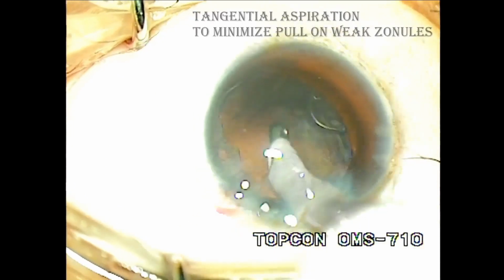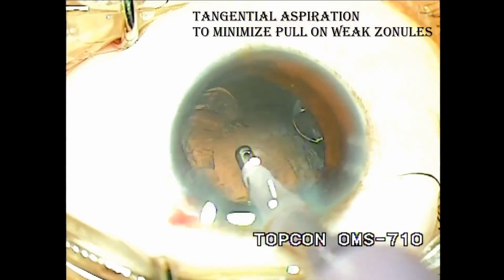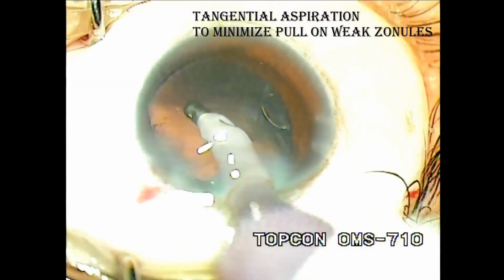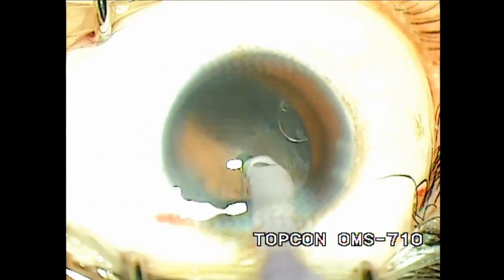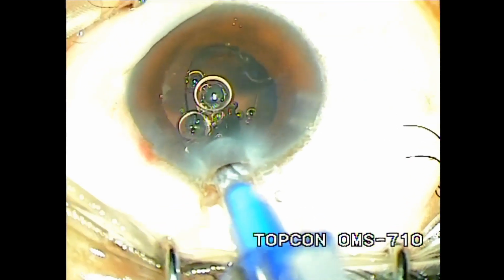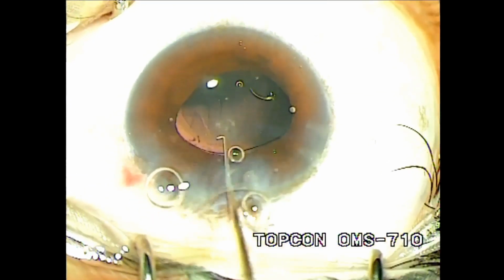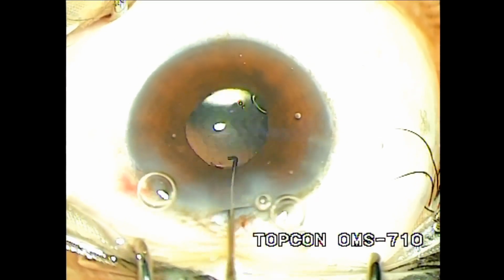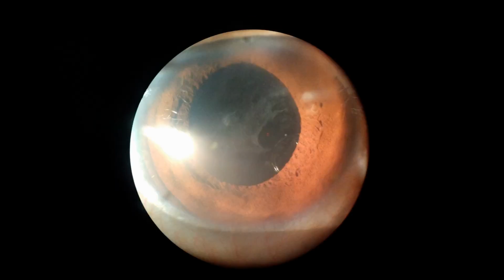During cortical aspiration, tangential aspiration should be performed rather than radial aspiration to minimize pull on the weak zonules. Once the bag is stabilized, the regular posterior chamber IOL can be inserted into the bag. On the postoperative day 7, the patient had a visual acuity of 6/24 with pinhole. It is improving to 6/12.